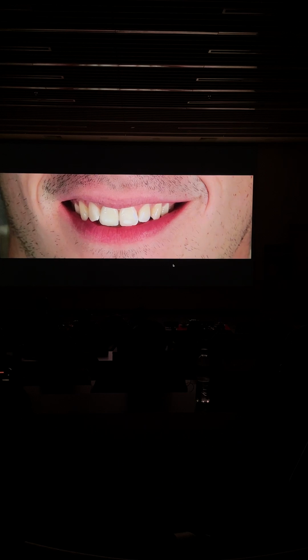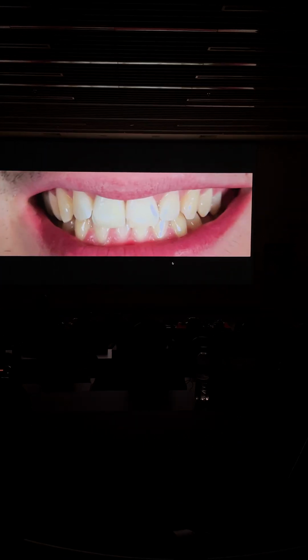Of course, we desiccate the tooth and the color doesn't look nice. And then he's coming back a month later. And we're asking him how happy he is. And this is how the tissue is coming back little by little. Even though we have a distal rotation, the tissue is coming down, and it's a matter of time before the tissue will come down proximally. Be careful every time that you place a single tooth implant.